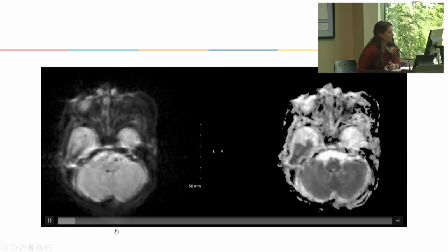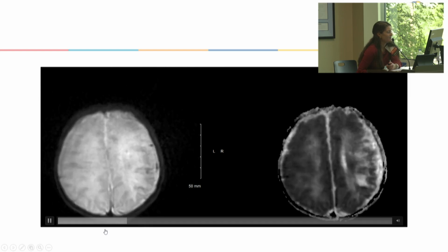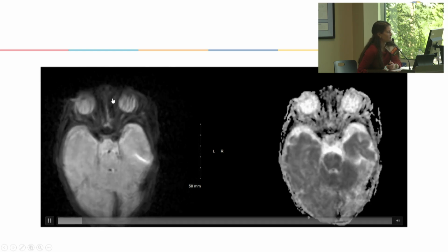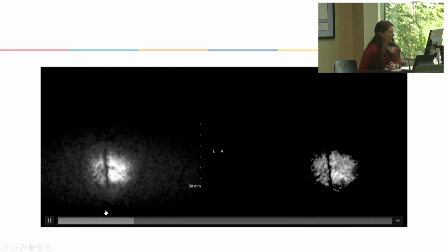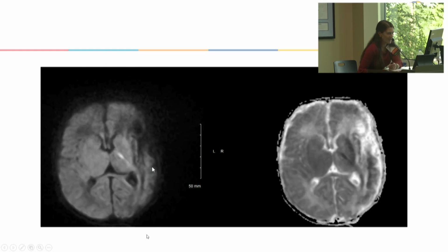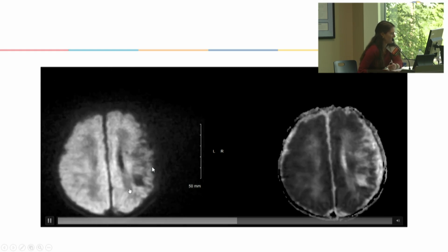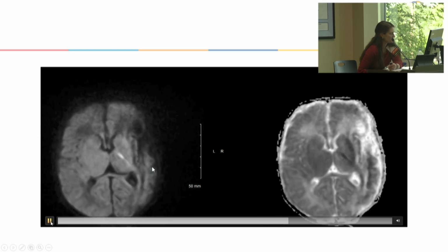And then, this was a diffusion weighted image, again, after 2 weeks of injury. I made a point to show something doesn't look like the last diffusion image on that DWI, right? It doesn't look bright. That's because sometimes you've got to keep scrolling. So you want to scroll through to the B1000, and then you will get a nice view. So you can see there is still diffusion restricting. Look, the internal capsule's diffusion restricting.